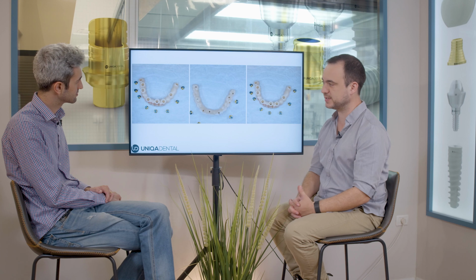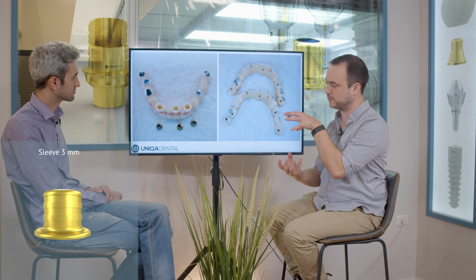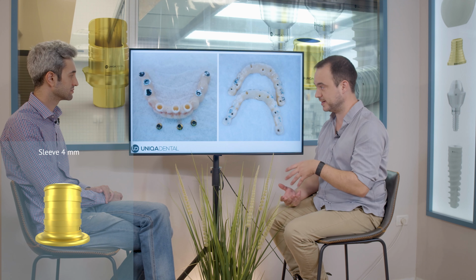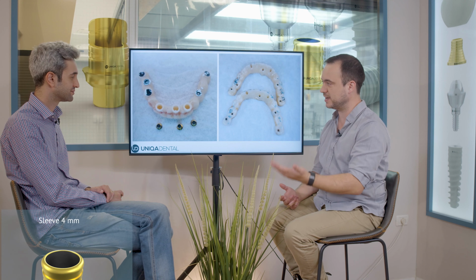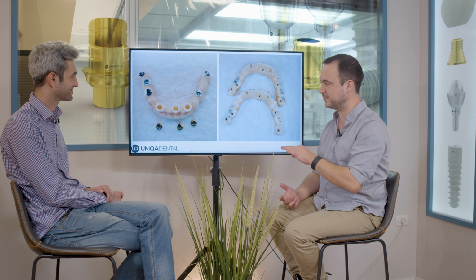that doesn't break down. What you see here is, first of all, we prepared the bridges and all of the sleeves with the screws, with everything. Everything is prepared. Now, what we do, we insert some of the sleeves, and we need the sleeves to hold inside the cavity for the sleeve, right? Because if you just flip the bridge, everything will fall down. So we use toothpaste. We apply it on the sleeve and we hold the sleeve in place.